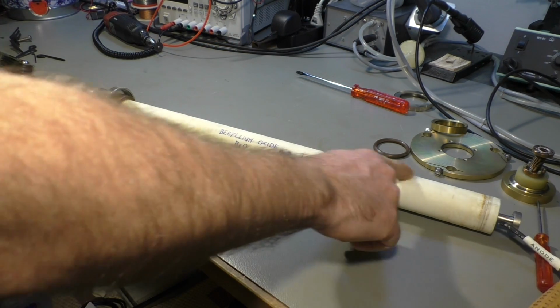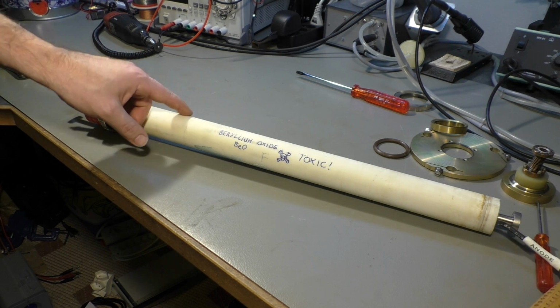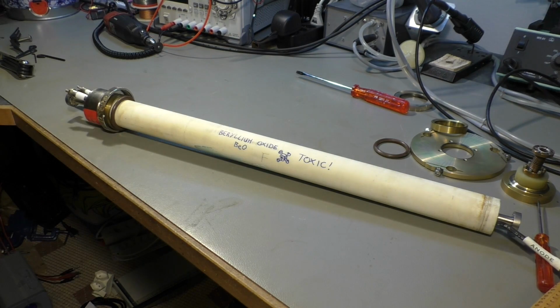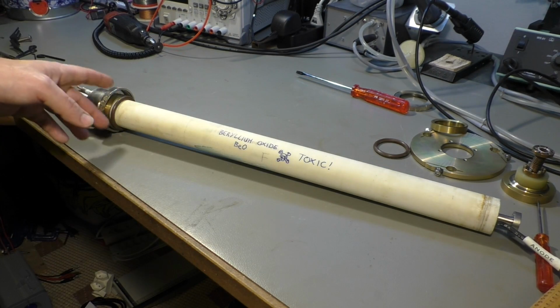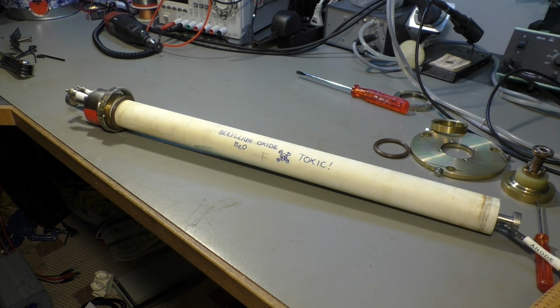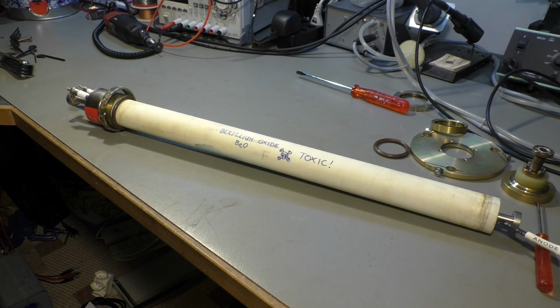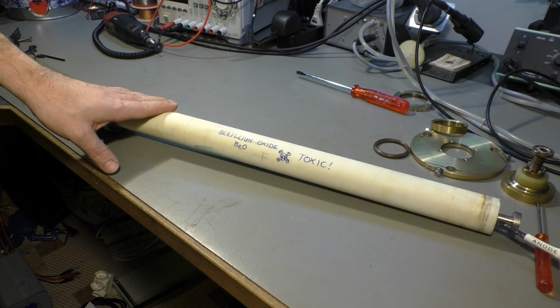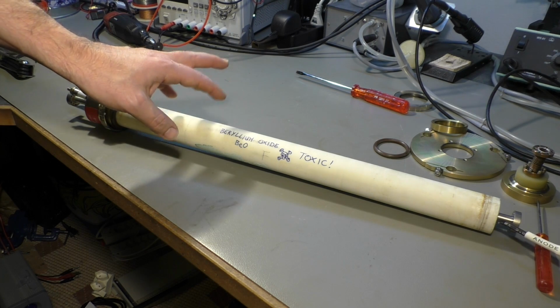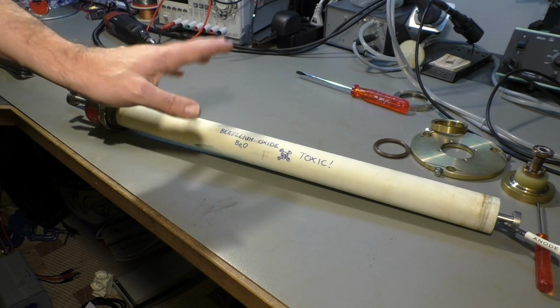It's not dangerous like that. It doesn't rub off in any way. But, well, maybe you shouldn't lick it, but you should absolutely not destroy this stuff. Okay, just leave it in one piece. And if you have to dispose of it, take care that it doesn't just go to the landfill or something. So it has to be disposed of properly. This is really an environmental problem if that goes somewhere. So just to repeat that, do not break it, do not grind it, do not drill it, do not smash it into pieces just to have a look inside. Don't do that.